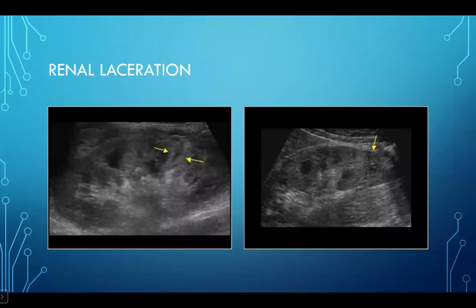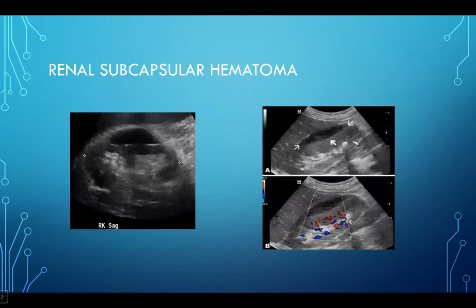This is the renal laceration as detected by FAST. And this is the renal subcapsular hematoma.